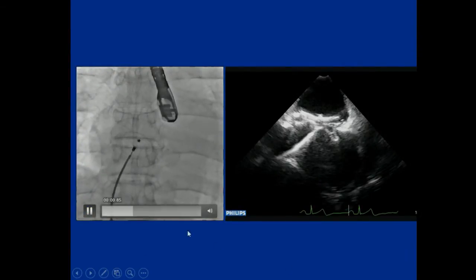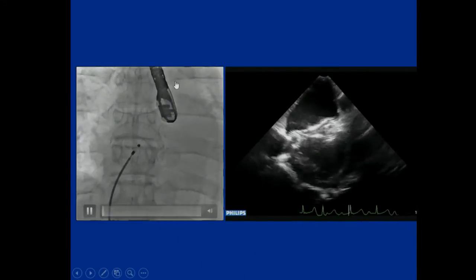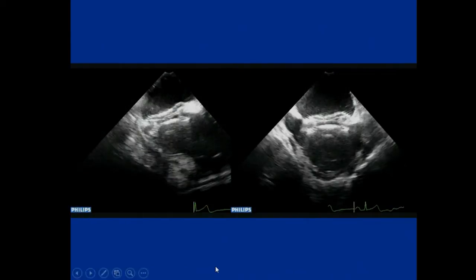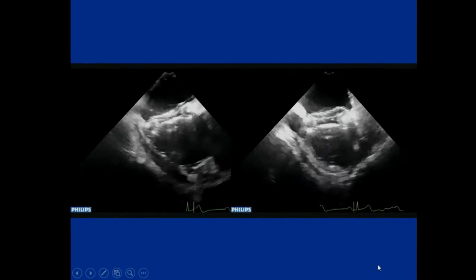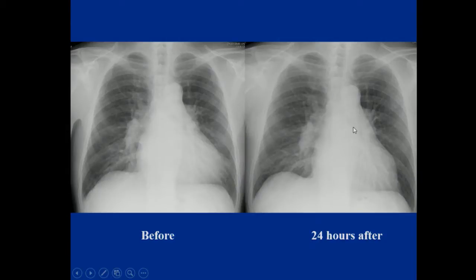This shows releasing the device; the procedure was completed. Compared to surgery, the transcatheter procedure provides hemodynamic improvement quite rapidly. Just 24 hours after the procedure, the chest X-ray of the same patient looks totally different — cardiomegaly was completely resolved.